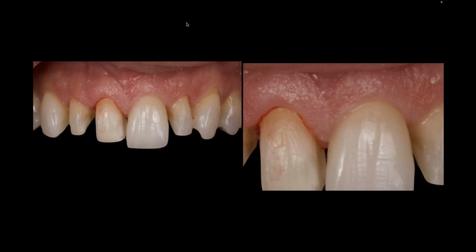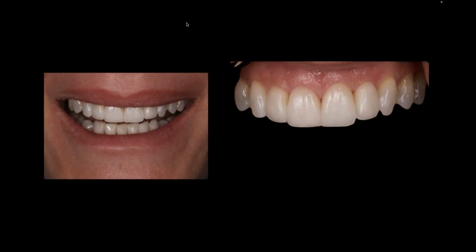So I was really trying to follow that, right? You'll notice in my cervical, you see more of a chroma. In the middle third, you see that brightness, and as I get down towards the incisal edge, I'm trying to keep the same density that I see in the adjacent or natural teeth. This way they blend in together. So we'll put those 4 veneers in. She's still a little numb here, but you can see they blend fairly well.